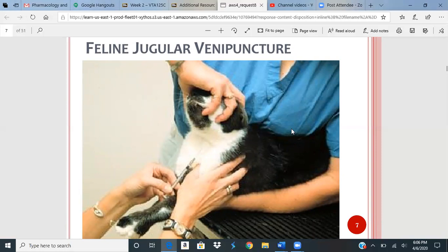Actually, you're going to see it in your nursing class in 160. But it kind of looks like, what's that movie? Silence of the Lambs, where they put that face mask over the scary dude, serial killer. Kind of looks like that, but it covers their face. They can still breathe because their nose is not covered up, and then it goes over their eyes. We prefer, I think it's a little safer, especially when you're first learning. You either do, like I was telling you, put one thumb underneath the chin, one on the head, or you put your hand behind the head away from the mouth and do that baseball hold.